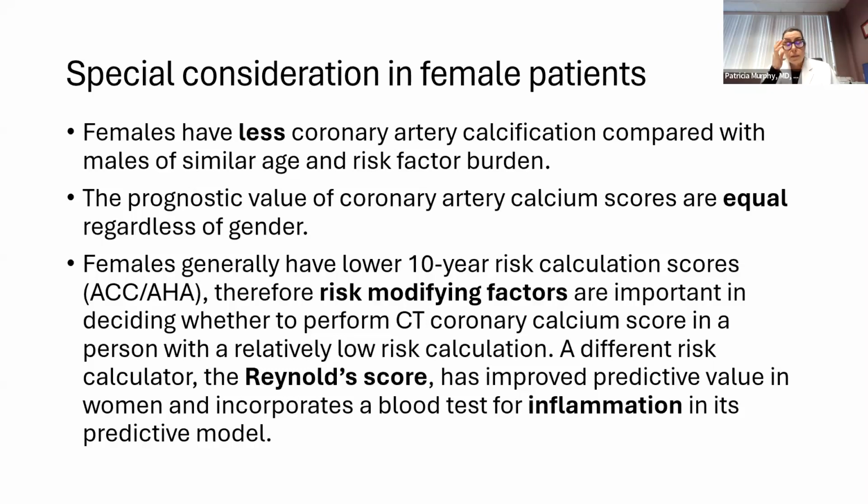So, some special considerations in female patients, and this is important because females have less coronary artery calcification compared with males of similar age and risk factor burden. We've talked about those risk factors earlier. But the prognostic value of coronary artery calcium is equal regardless of gender. So if you have calcium, men and women have similar prognostic scores.